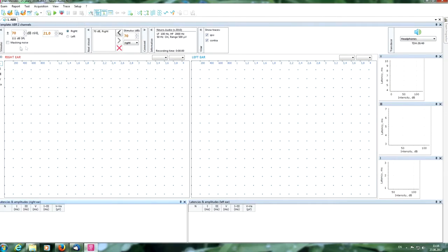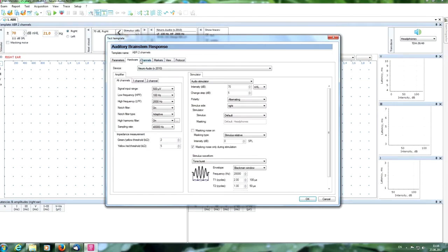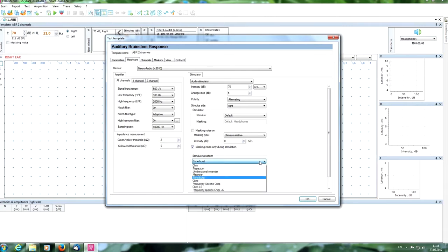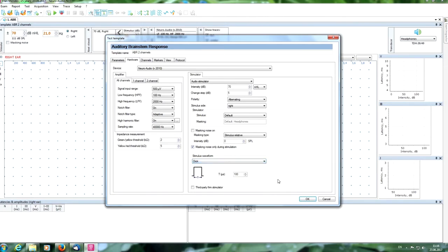Here we can see some parameters of stimulation. All the necessary settings you can see here. Also you can change. You can see stimulation rate, analysis, hardware, filters, sampling rate, stimulus parameters. You can choose from the big list. For example, chirp stimulus, tone burst stimulus. Today we will use click stimulus.